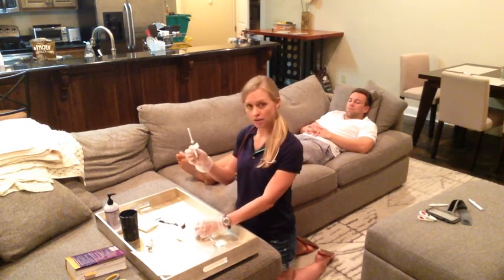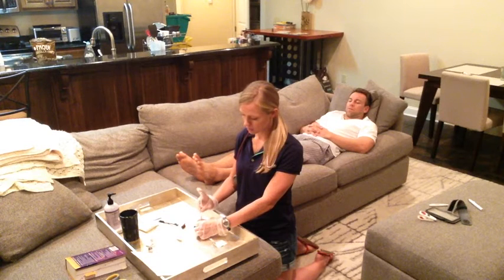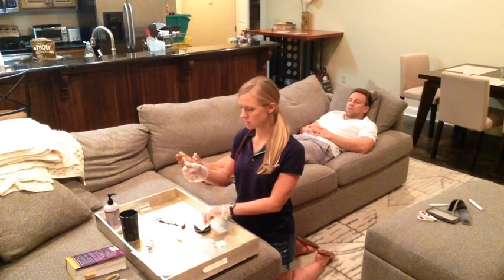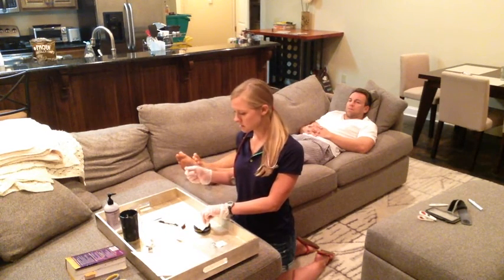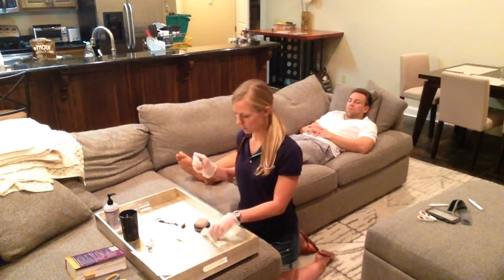We would pinch the area. We would inject 90 to 45 degrees like you're throwing a dart. And then we would inject the medication. You might tell the patient he might feel a burning. Inject the medication. We would grab the gauze as you take the needle out, put the gauze over the site. You would immediately use the safety device to cap the needle and put it in a sharps container. You would hold the gauze for a few more seconds. And then that would be that.